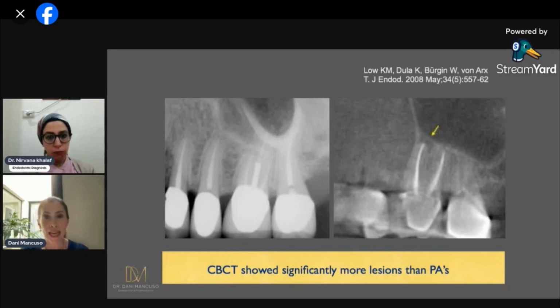And I could understand that there was not much I could do without the CBCT in cases where I couldn't find where the apical pathology was. That is because of the landmarks and the lots of interference on the conventional X-ray, and the density of the bone as well, the zygoma, all of that.